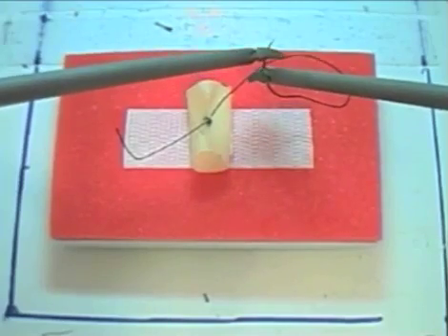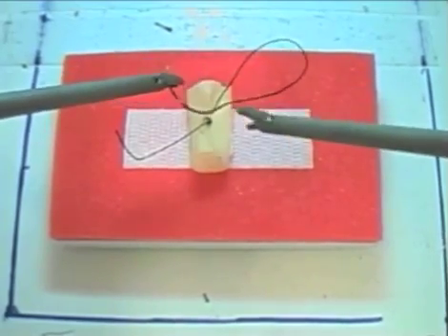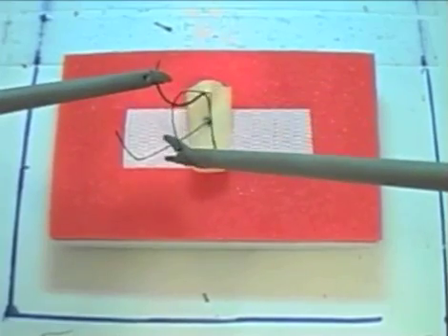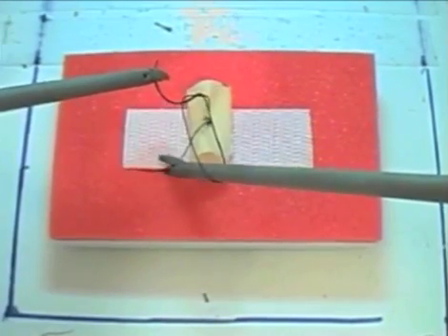For the next throw, the needle is transferred to the other hand, maintaining the alignment. And only a single wrap is required for the next two throws.